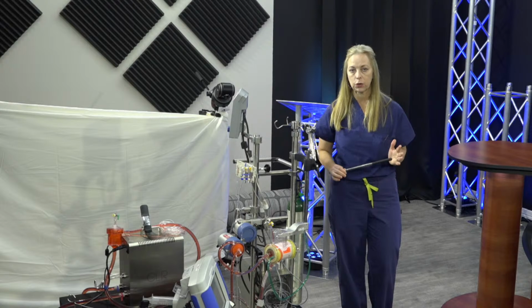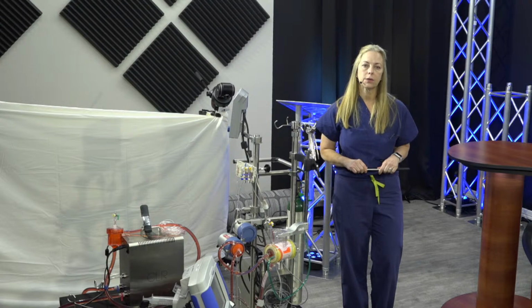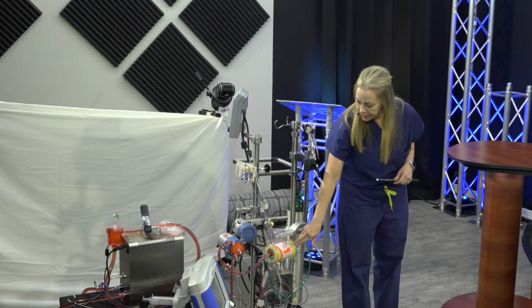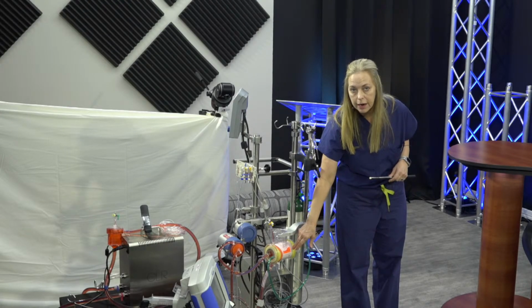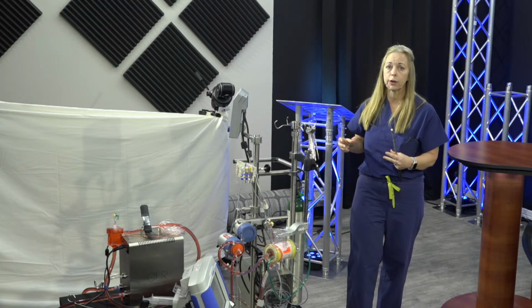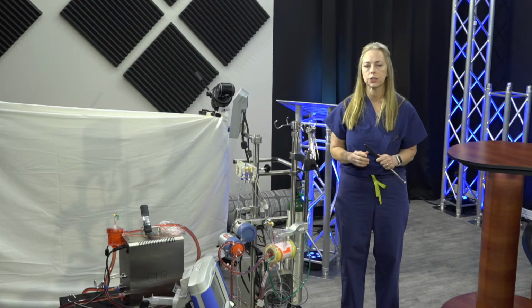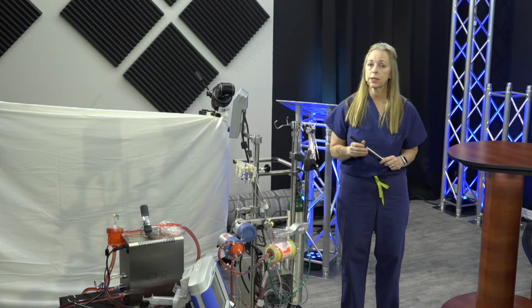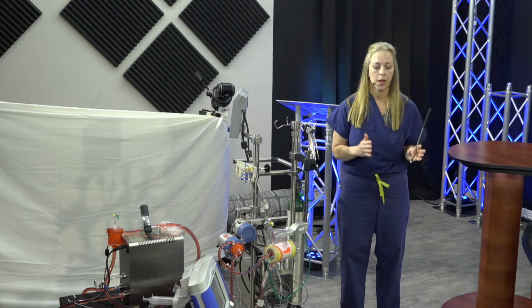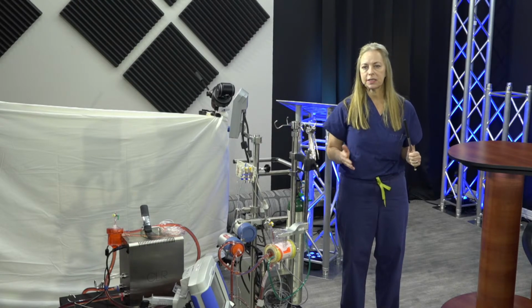We're not able to actually see them even though we're checking for them, right? So this is a way to be able to sort of see inside of the oxygenator, or perhaps if a clot is on the outside and you note it, you know it's there. Is it just that little portion, or does it extend fully into a very large clot inside the oxygenator? By being able to test your oxygenator blood volume and really use it as a trending device, it's 180 to start. That's what we primed with.